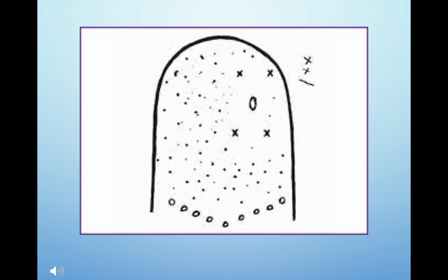The figure shows the 4-point technique of LA administration. LA should not be given too close to the lesion, as cellular edema may be confused with the true lesion. Additional LA infiltration can be given for better anesthetic effect.